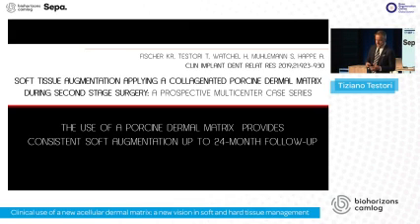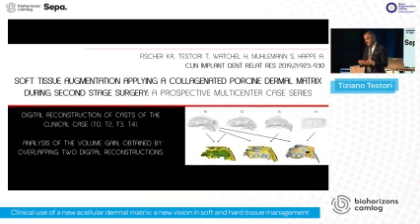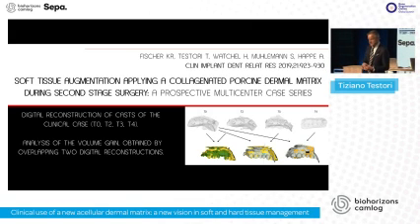We did a prospective multi-center case series in a quite scientific way, superimposing the cast or the scan using our optical impression in order to see the dimensional stability of our augmentation.